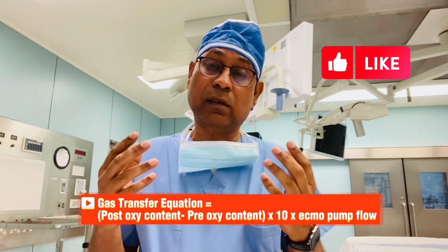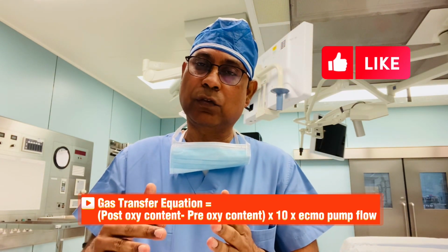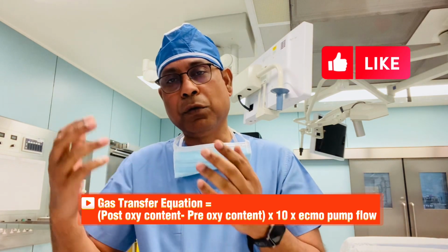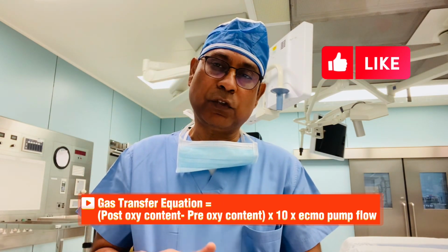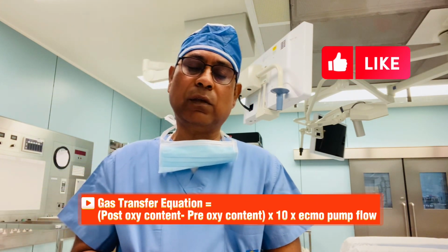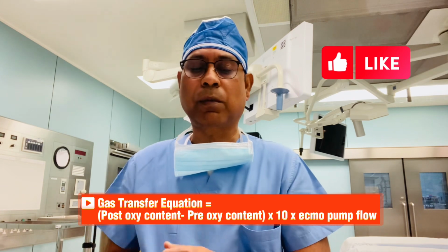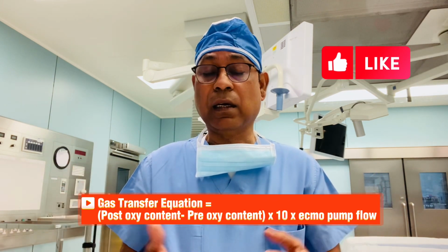There is a formula we use. By using the formula, we can understand whether the efficiency of the oxygenator is reducing, or if it is still in an adequate position. So today we're going to discuss the oxygen transfer factor equation.